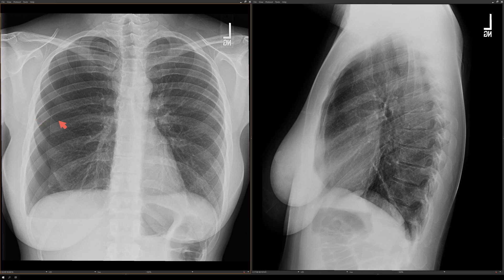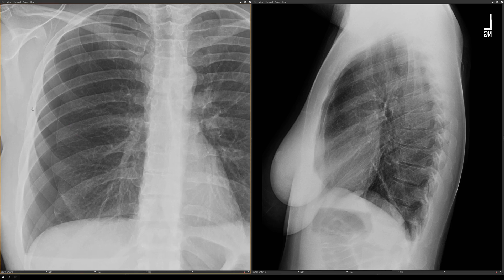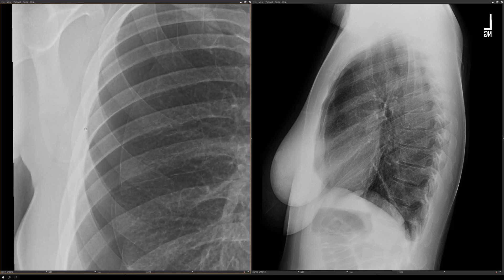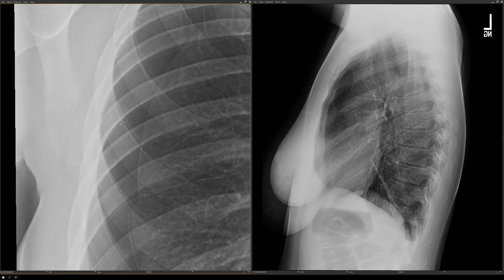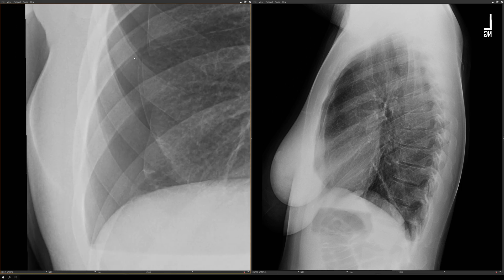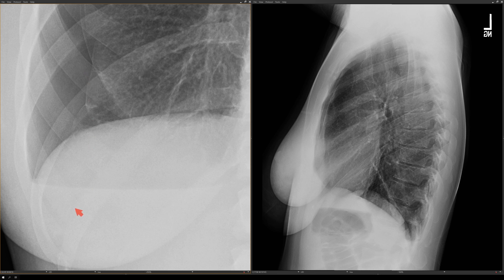Here's a patient in her early 40s who presented to the emergency department with right-sided chest pain and dyspnea on exertion. You can see there's a right pneumothorax. At the base, there's a horizontal line — whenever you see a horizontal line in radiology, think about an air-fluid level — meaning this patient has a hydropneumothorax.